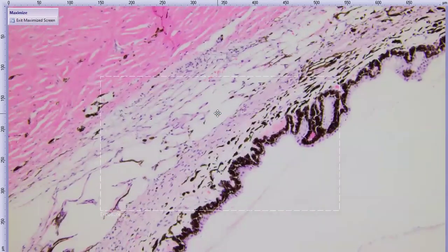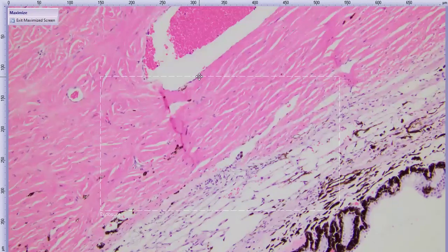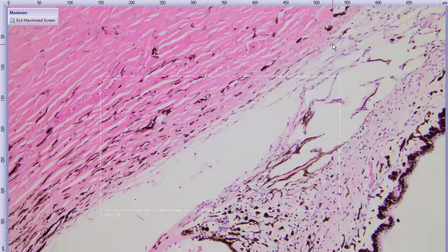But when we move a little bit posterior, we see a very nice ciliary cleft with beams of the trabecular meshwork that then lead off into the actual aqueous humor outflow tract. So as Megan pointed out earlier, here's the vessel of the angular aqueous plexus, so aqueous humor flows out this and joins up into the scleral venous plexus, which then ends in the venous system. And that is how the intraocular pressure is maintained in an eye.